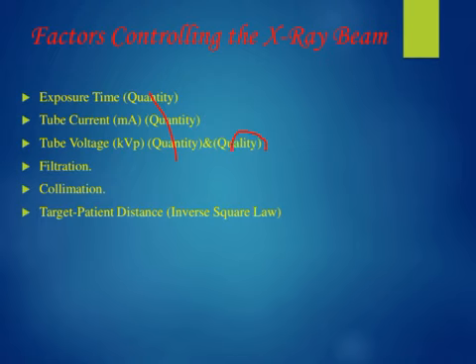Only the kilovoltage potential, that is the tube voltage, determines the quality of the X-ray production.